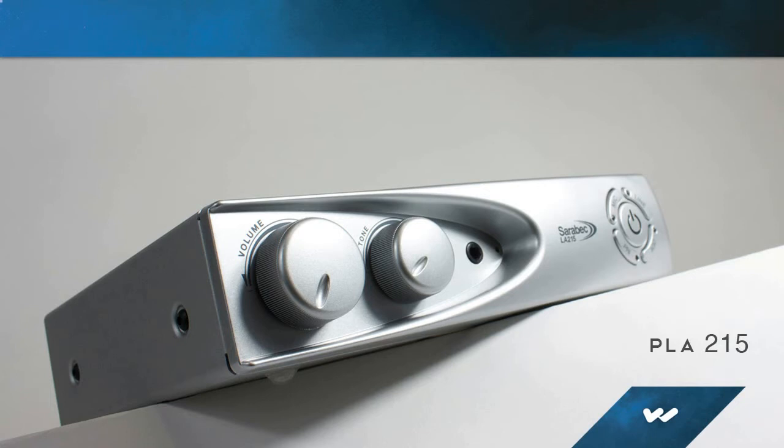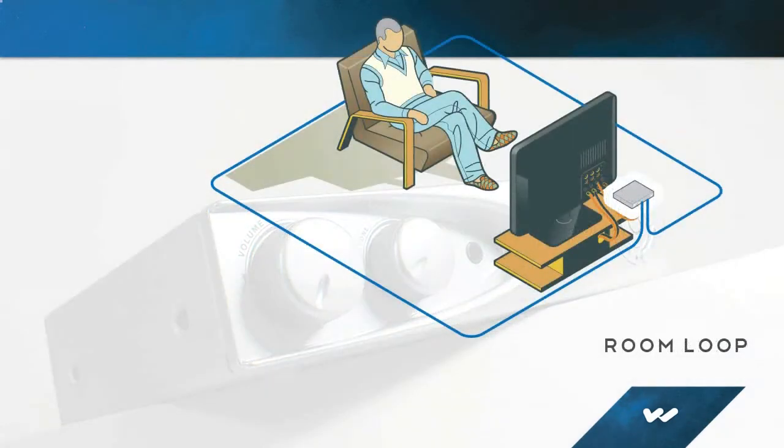The Hearing Hotspot Room Loop, PLA-215, is ideal for use at home or in small conference rooms up to 540 square feet. Inductive audio signals are transmitted via the connected wire loop, coupling directly to hearing aids equipped with T-coils.